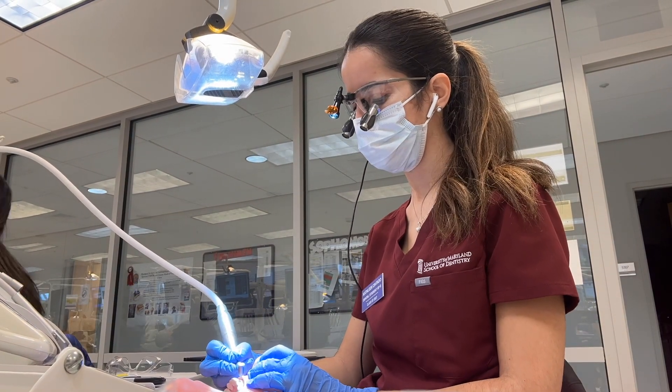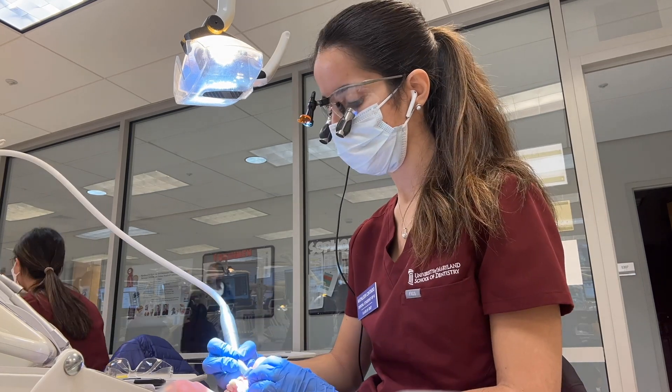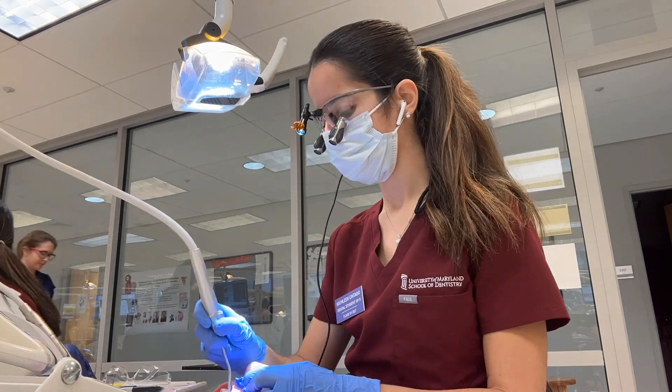Here's another time lapse of me drilling. At this point my hand was starting to cramp up a little bit as I was working on my second prep.